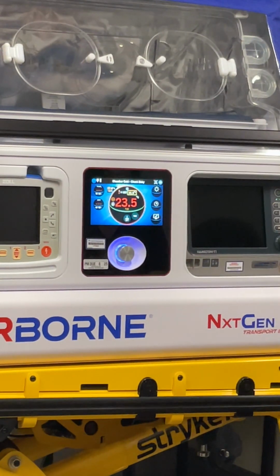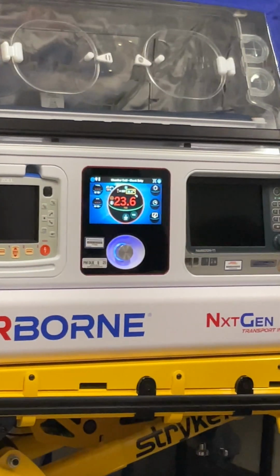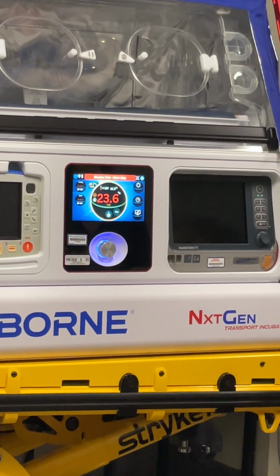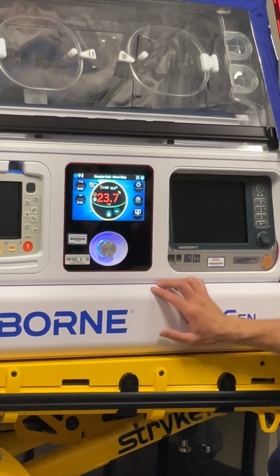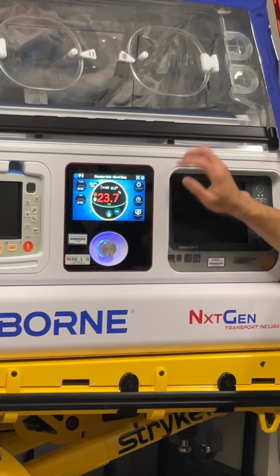Do we leave it on right now? You would. That's what he didn't go over. We preset them to 30. Both of them are going to be preset to 30. Okay. That's why it's at 30, because I was like, I don't remember it being that low. Because we did it. Yeah, okay. Hey, you did it without me, right? Yep. Okay, so right now that's the chamber. That's actually the patient chamber right now.